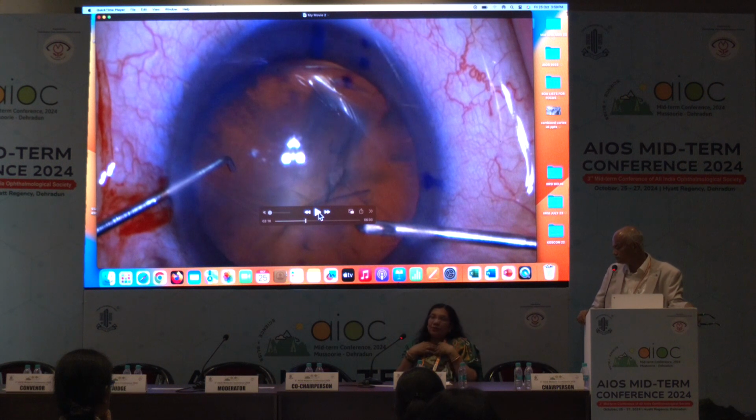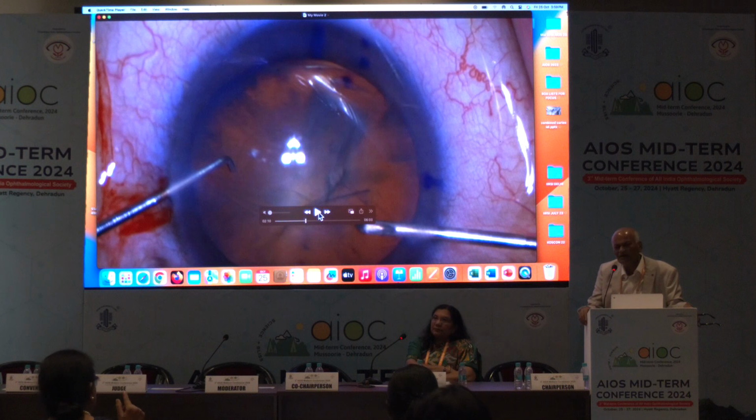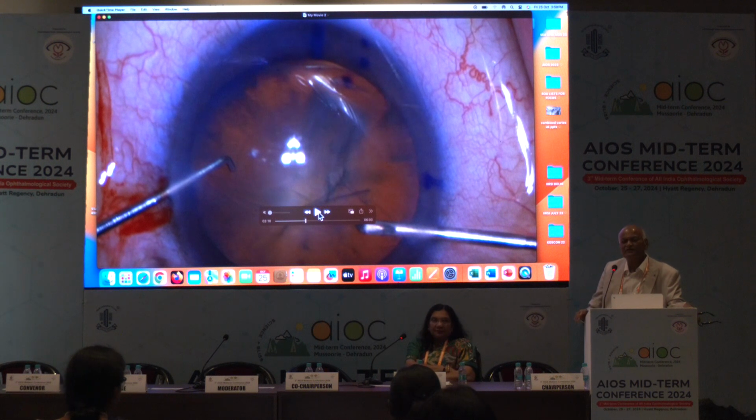So sometimes it is not your fault at all. Like sir said, your new sisters or somebody has to be trained to see that all these things are correctly placed or fitted. Because this may cause a problem, yes ma'am. It is very difficult to negotiate through that. Very true. What madam said is very true, that in 1 or 2 cases the sleeve is loose.